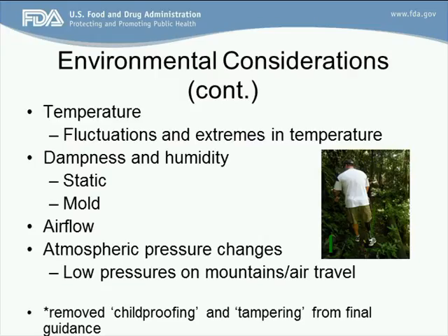And then you have very damp tubing, or I keep going back to tubing, but that is a big problem. Can you get mold in that? When you're looking at airflow, do you need to keep that device away from the wall, or can it be pushed up against the wall? Do you have a problem with overheating if it is up against the wall? And that's just considerations for your particular device.